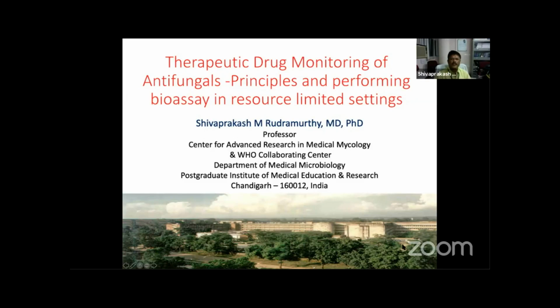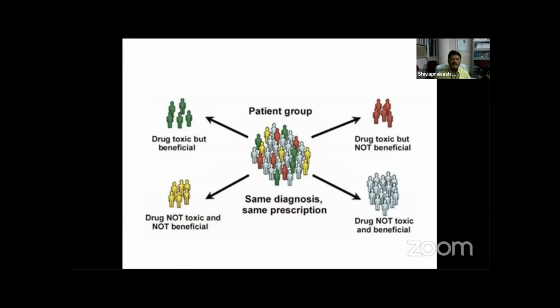I've been asked to talk on therapeutic drug monitoring of antifungals, mainly the principle and performing the assay in a resource-limited setting. So first of all, you have to know that in a patient group with the same diagnosis and the same prescription, whenever you give any drug, it does not behave in a similar way in every person.